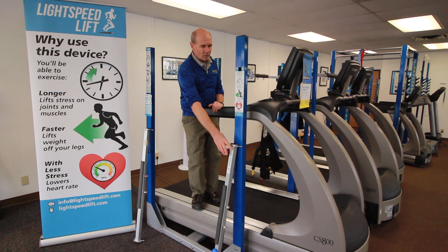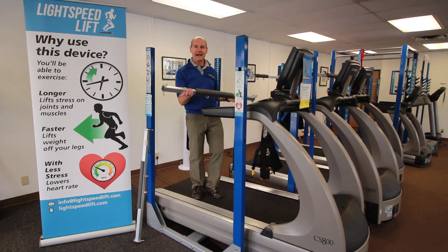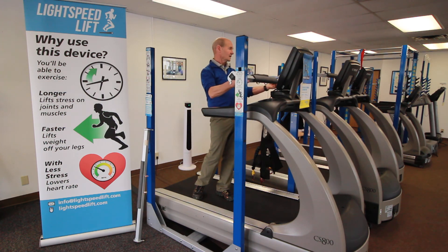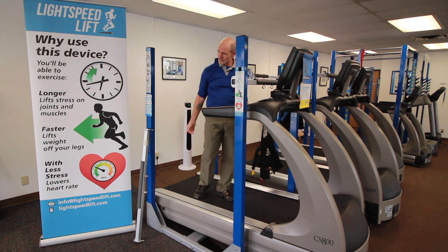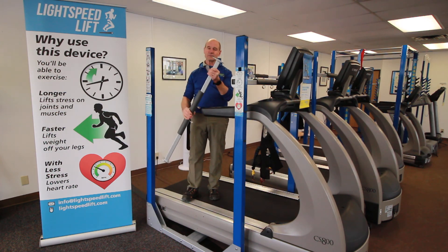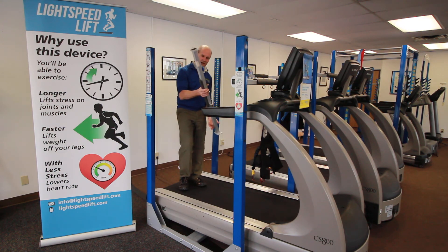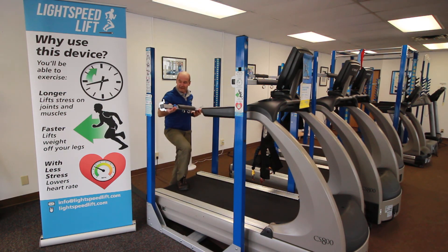And yet, when I want to make this a body weight support system, I simply add on a bar to the front and the back. It's totally simple to do and the bars are incredibly strong and effective.